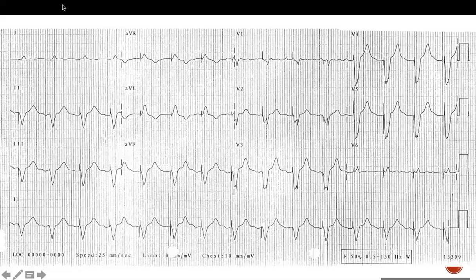Okay, this ECG. How are we going to read this ECG on an exam, to someone over the phone? What I saw is paced ventricles. The only spiking I can see is before each QRS, so this should be ventricular pacing. So you're saying this is ventricular pacing. Okay, anything about the atrium? Nothing. I think it's a single lead.